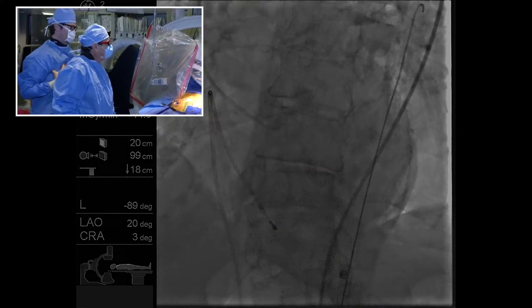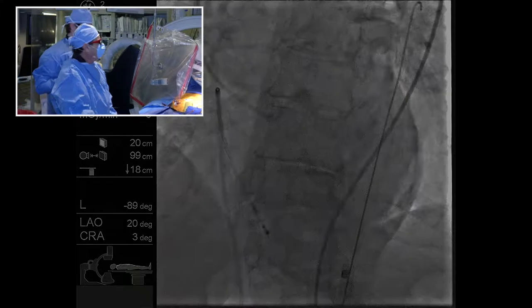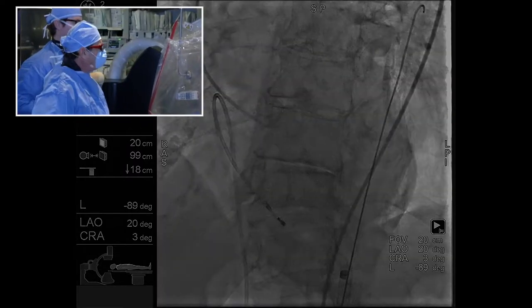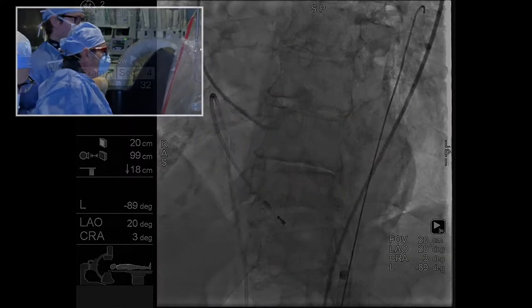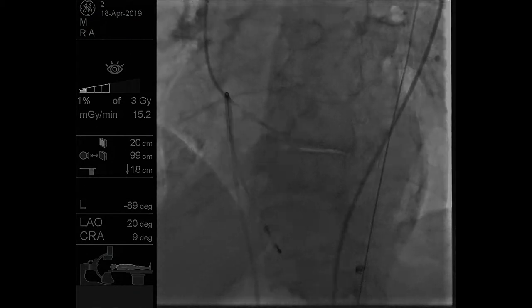So we're going to go cranial a little bit here. The middle one is the right coronary, although it's in the middle. We should call that the middle. Creatinine was what here? Normal. Okay. As I inject dye, my instinct is to ask what the creatinine is, just to make sure. Is it better, or do you want to go further? That's pretty good. Maybe a little further. I think a little more. And then this is probably going to be perfect.